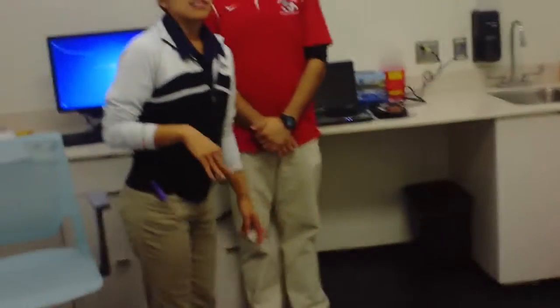Test number 5 is going to be the eye exam, the vision exam, with the Snellen eye chart. So what I'm going to have my patient do is stand 20 feet away. Generally, we would have him stand 20 feet away from the eye chart at eye level and have them read the Snellen eye chart.